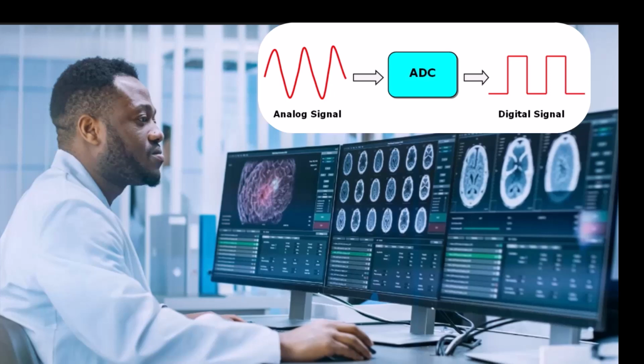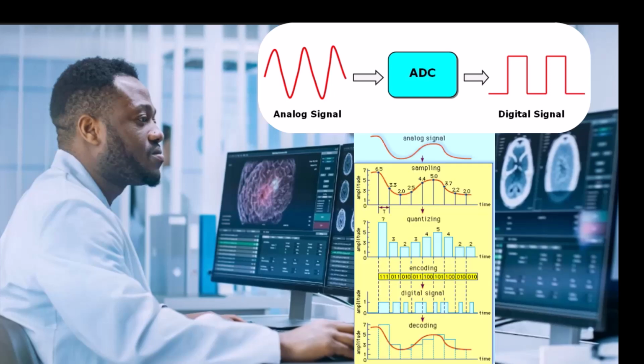Once the MRI modality captures the data or signal, you need to have an in-depth knowledge, both the physician doing the interpretation and the technologist acquiring the data, of analog to digital conversion in digital imaging.